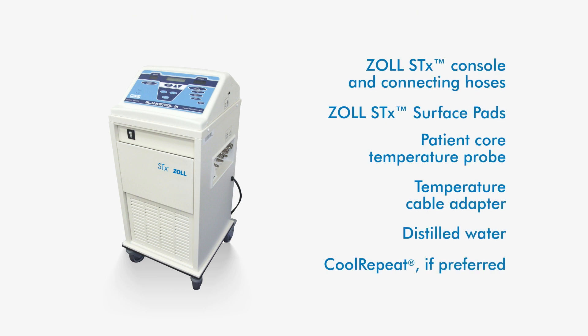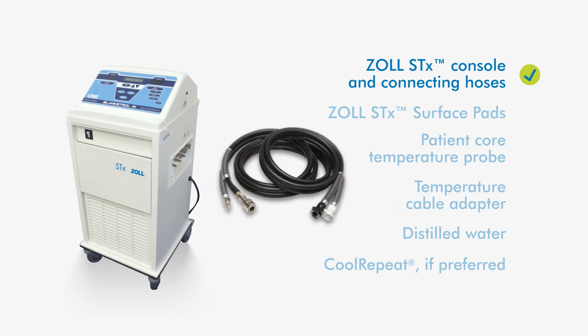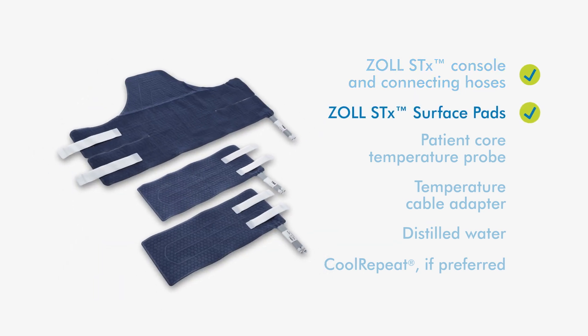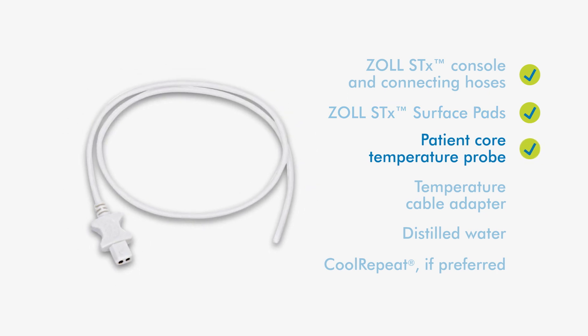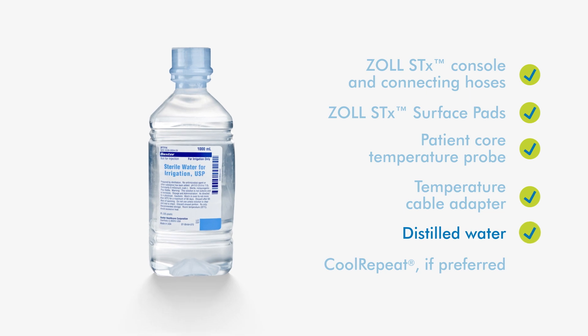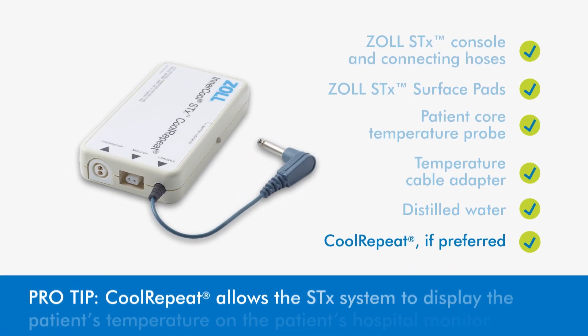To begin, ensure you have the following equipment: Zoll STX console and connecting hoses, Zoll STX surface pads, patient core temperature probe, temperature cable adapter, distilled water, and cool repeat if preferred.